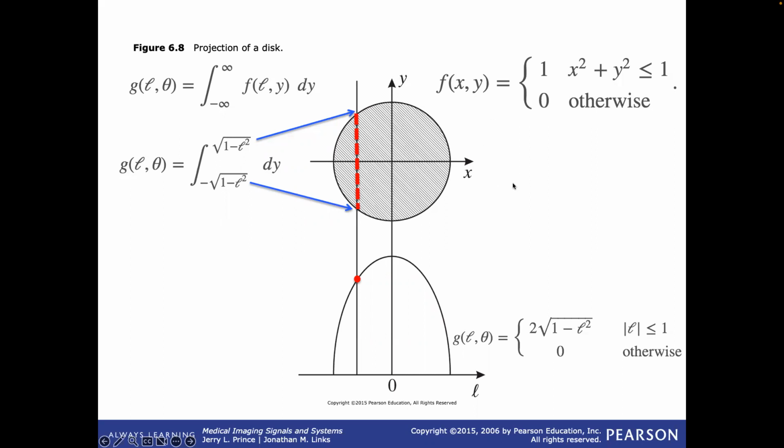Oftentimes when you run a CT simulation and you're asking how small a sphere you can detect with your scanner, you can run that simulation by calculating the analytical image after the X-rays hit your object, if your object is, say, ellipsoids.